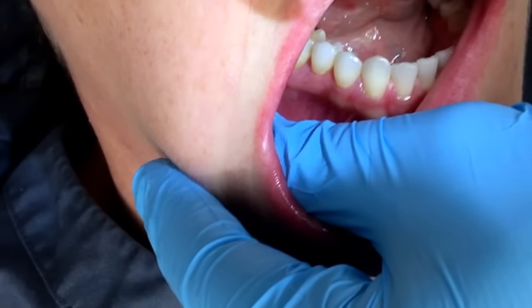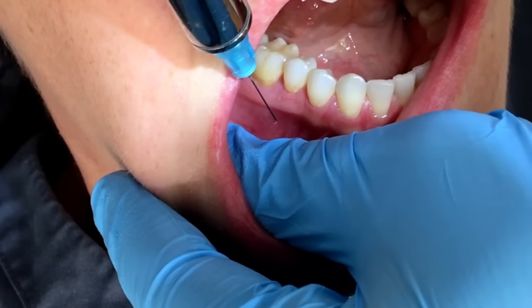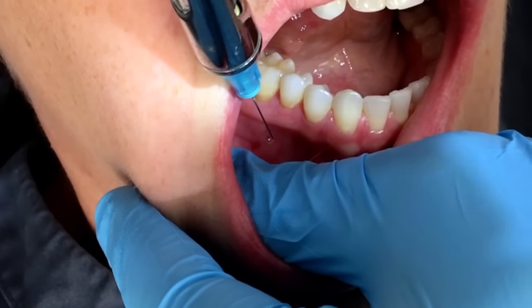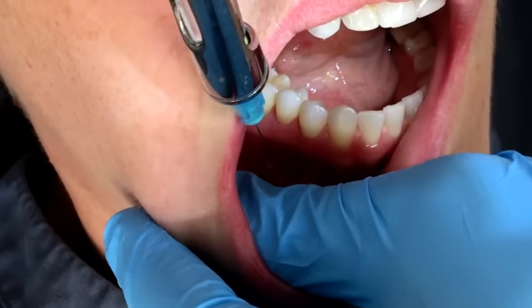You want to be aiming between the two premolars. You can also look at your x-rays and see where the mental foramen is on your particular patient — does it go a little closer to the first premolar or is it a little closer to the second?